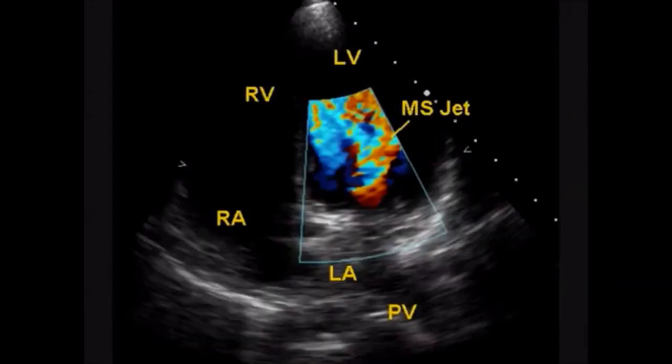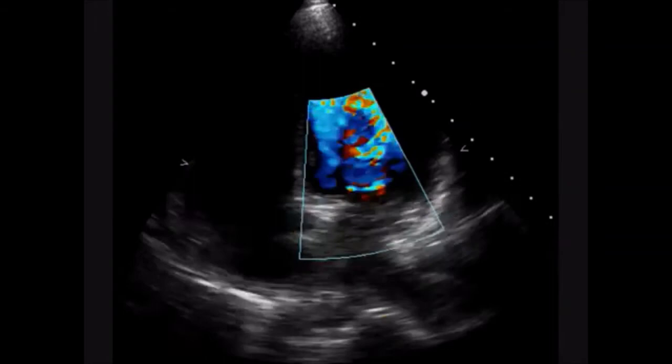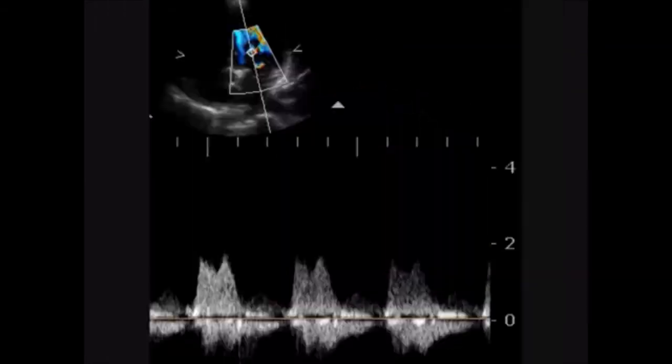This is the apical 4-chamber view. A forward jet is seen, indicating that partial mitral stenosis can persist after balloon valvulotomy.